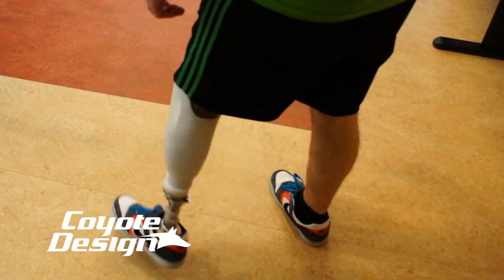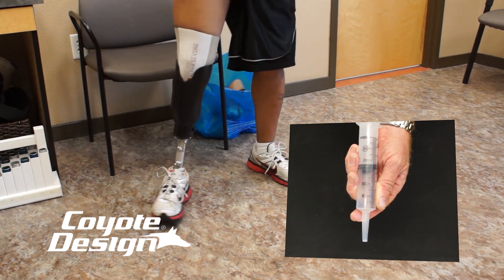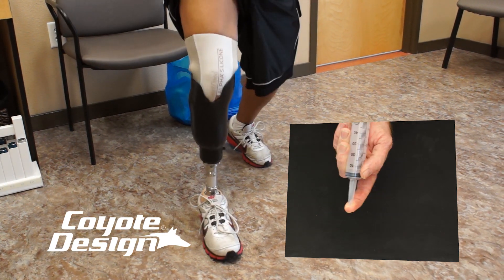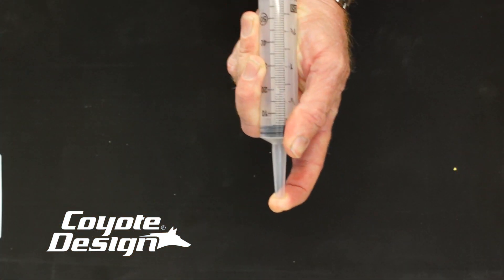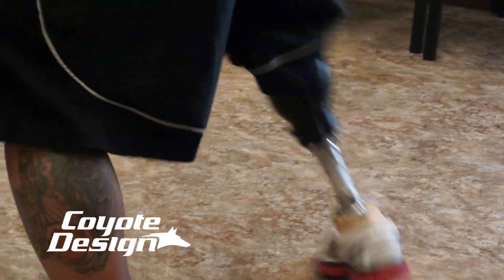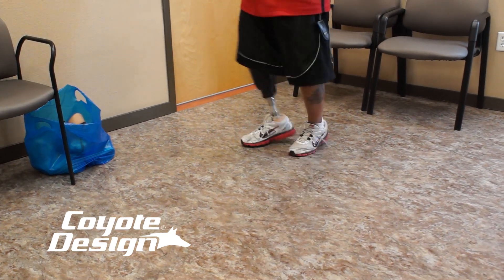A good example of how the suction in Coyote Designs Airlock works is to take a syringe and feel how easy it is to plunge the stopper back and forth. Now plug the hole with your finger and feel how firmly the suction in the syringe holds the stopper in place. Coyote Designs Airlock works similarly by creating suction inside the socket, even with a sleeve.